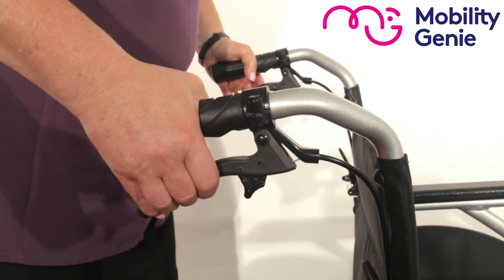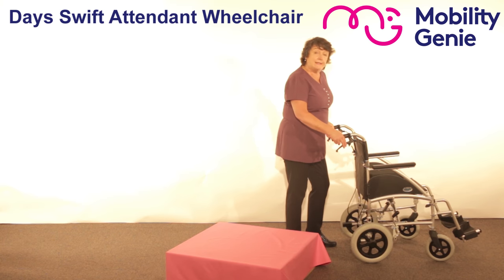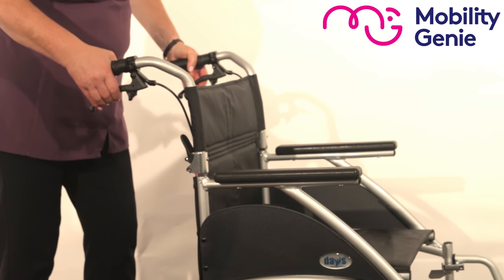There are brakes attached to this wheelchair. Because it's an attendant wheelchair it's an added bonus, especially when you're walking down a hill and you want to control the speed. You just pull the brakes lightly to control your speed as you go along.